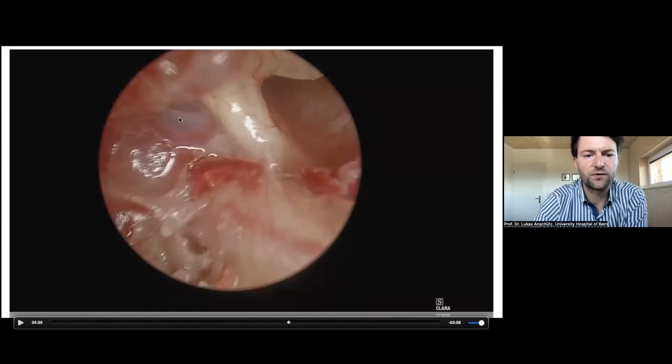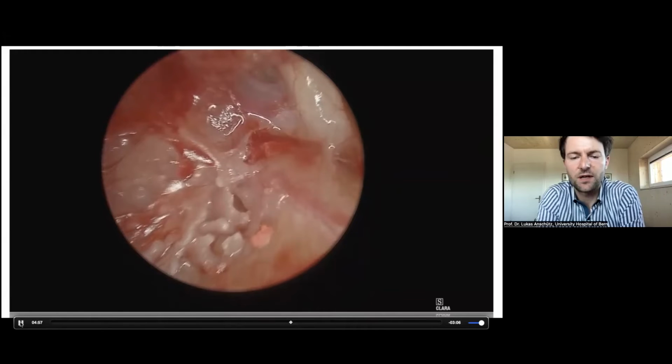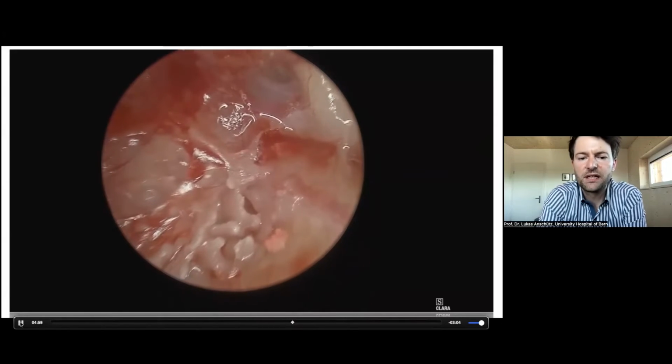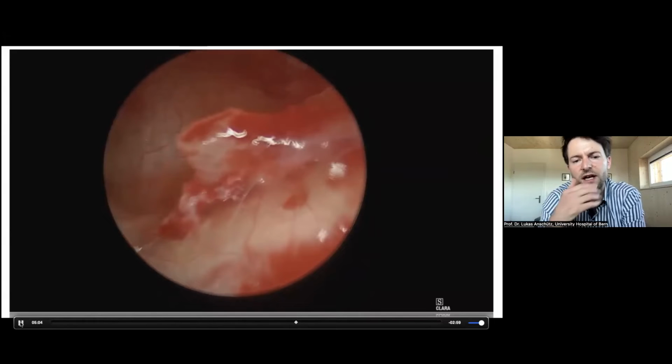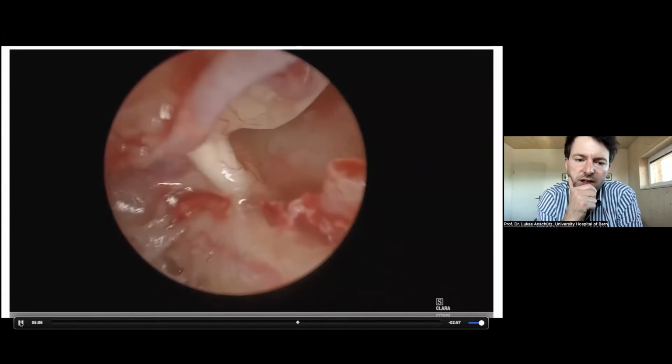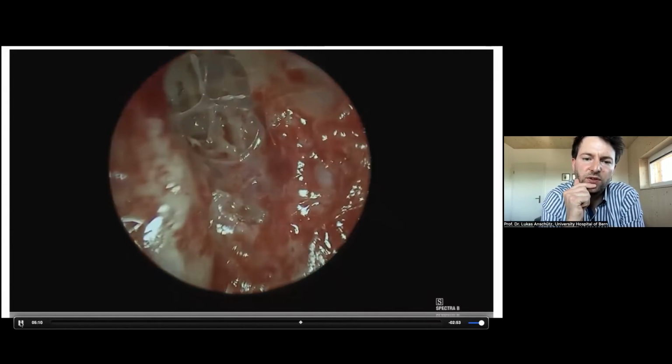And this might be one of the reasons why this patient has a cholesteatoma, because the ventilation of the epitympanum is actually completely closed. We saw in the beginning there was a scar in the isthmus tympanicus, and with the closed tensor fold, there is no way the air can go into the mastoid.